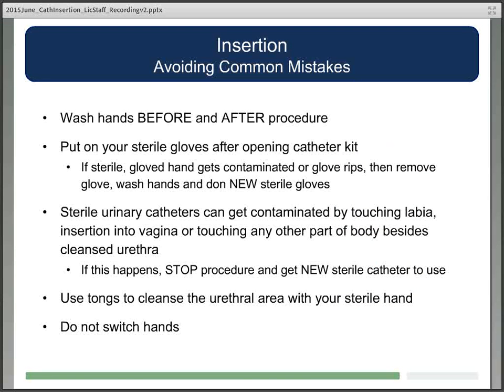Now that we've reviewed how to properly insert an indwelling catheter using aseptic technique, let's go over some things to avoid common mistakes. Clean your hands before and after prepping and before and after the procedure. Put on your sterile gloves after opening and preparing the catheter kit.